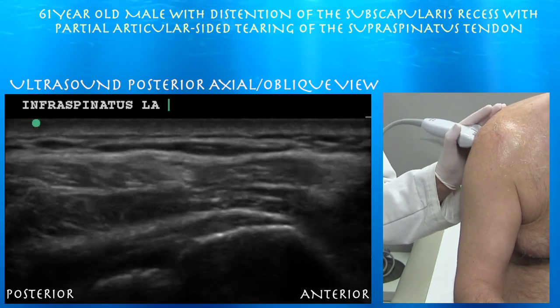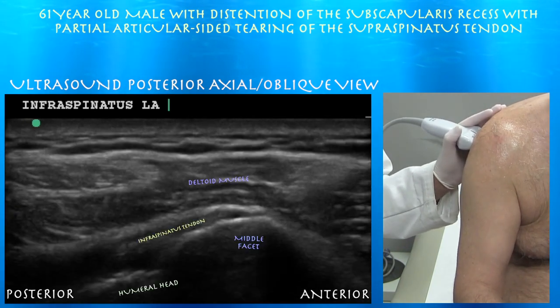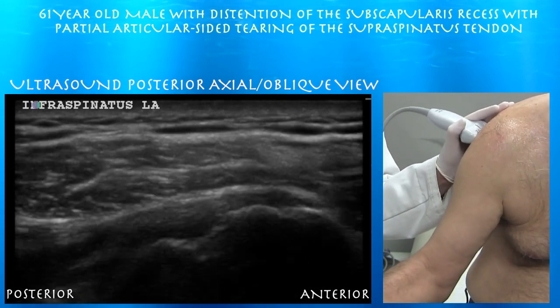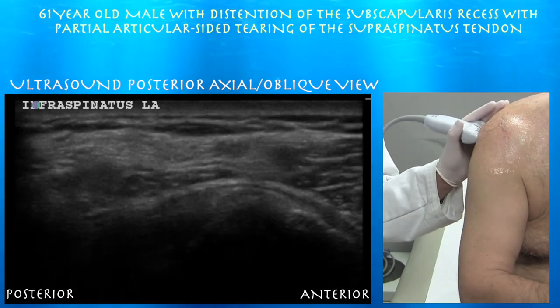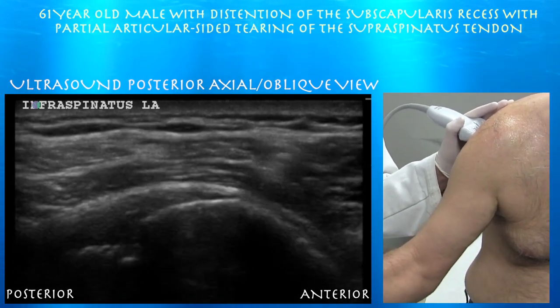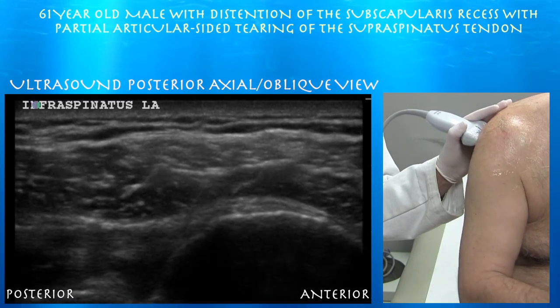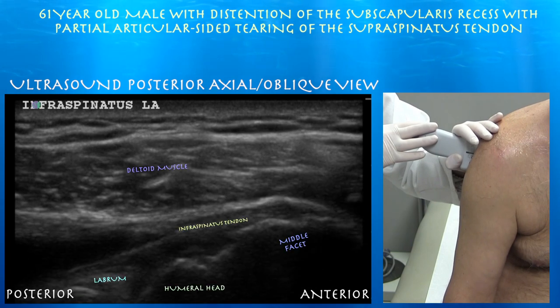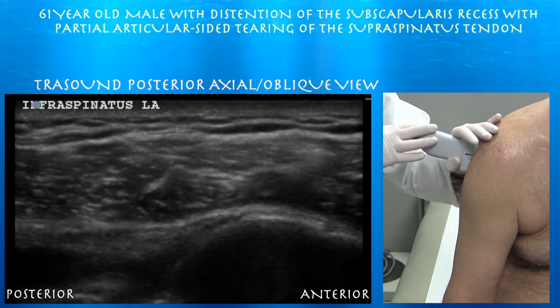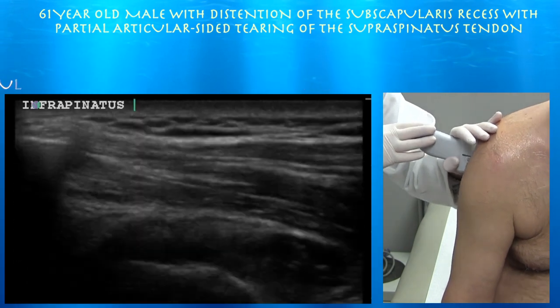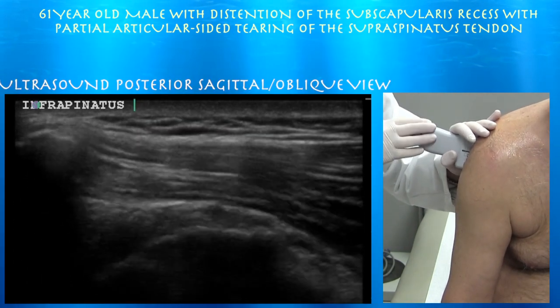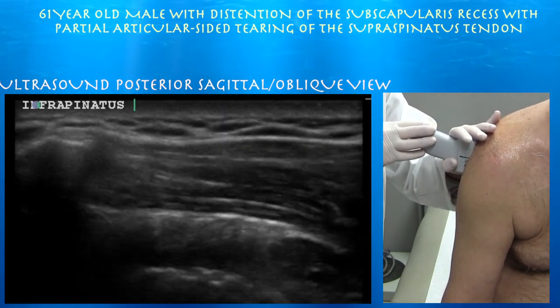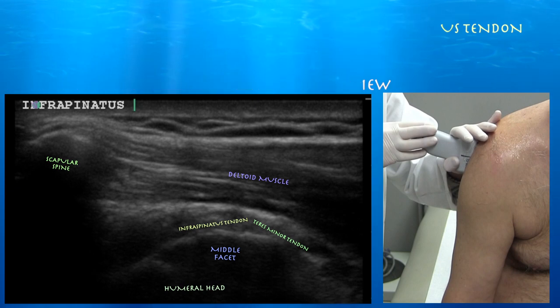Here's the infraspinatus tendon in long axis — you can see it attaching on the middle facet. It's always good to have the patient internally and externally rotate; you can see different parts of the infraspinatus tendon come into view during this, and you can also catch a view of the labrum. Here's a good view of the labrum abutting the humeral head. You can see the infraspinatus tendon attaching to the middle facet of the greater tuberosity. In short axis, the scapular spine on the left side of the screen means the infraspinatus is to the left and the teres minor to the right.